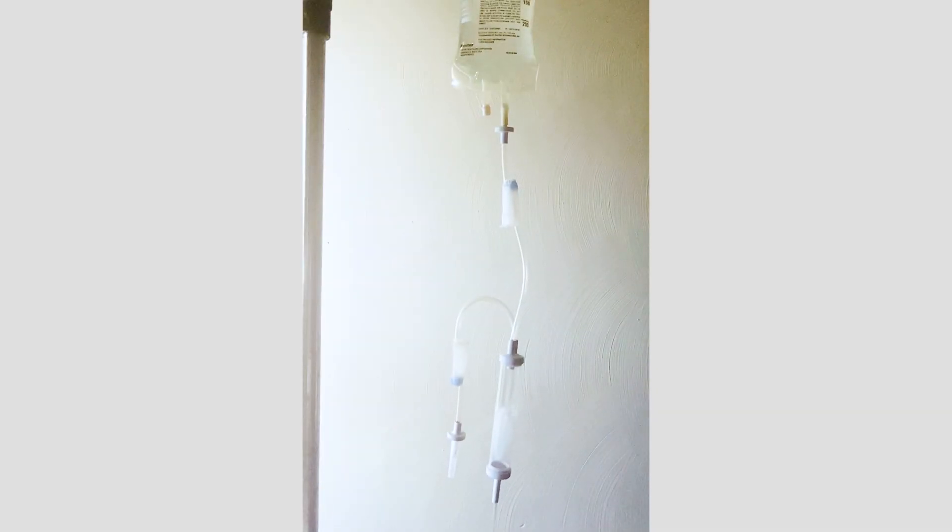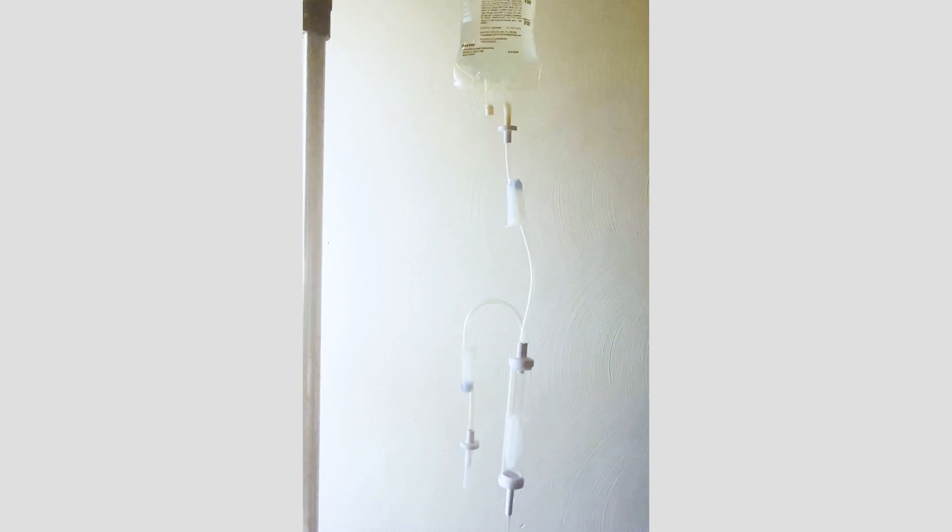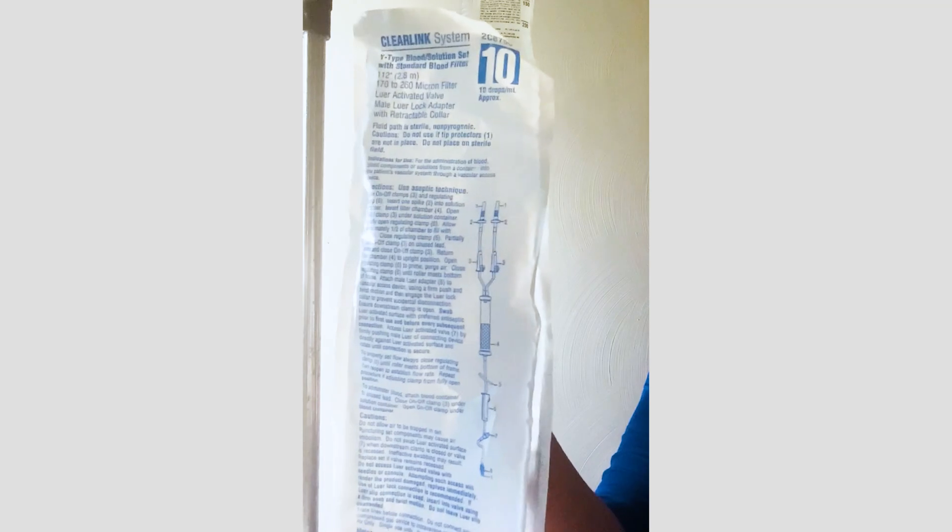This is a quick how-to video on priming Baxter's blood administration set that has a rigid drip chamber. All of our administration sets do have priming instructions on the packaging.